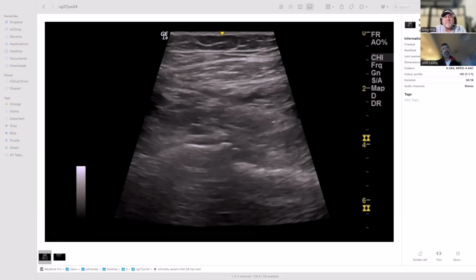I would be talking out of my six if I made any comment there. I don't see this population clinically. They come to me in the scan when they've already got to this point. So I'm not seeing these people year in year out and seeing it develop.